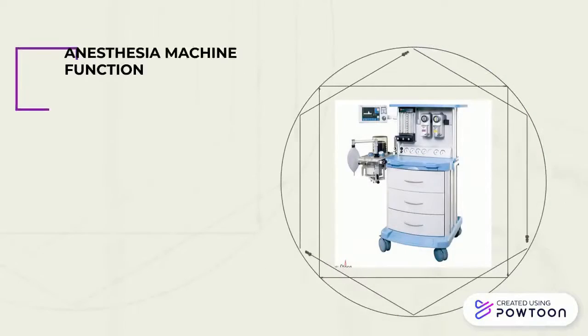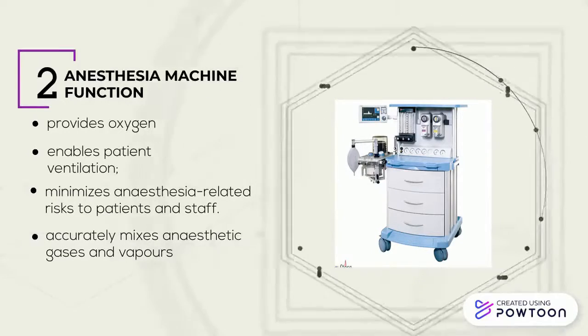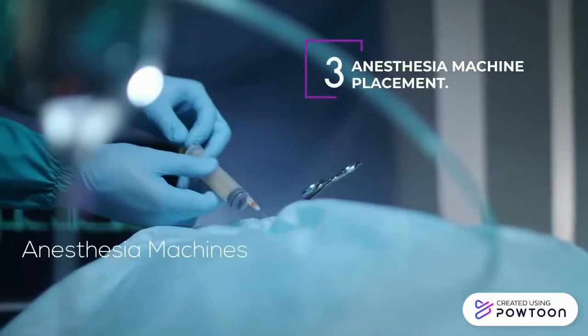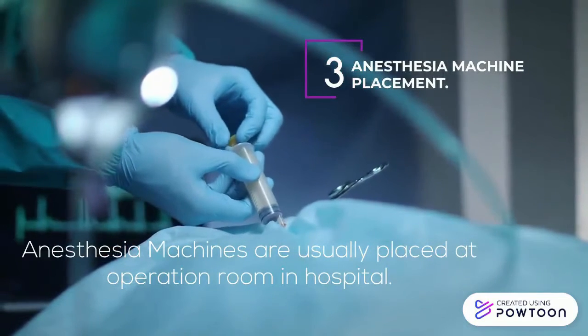Next is anesthesia machine function. First, it provides oxygen. Second, it enables patient ventilation. Third, it minimizes anesthesia-related risks to patients and staff. Last, it accurately mixes anesthetic gases and vapors. Anesthesia machine placement: anesthesia machines are usually placed in the operating room in the hospital.